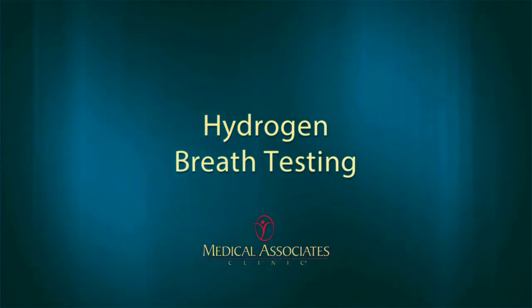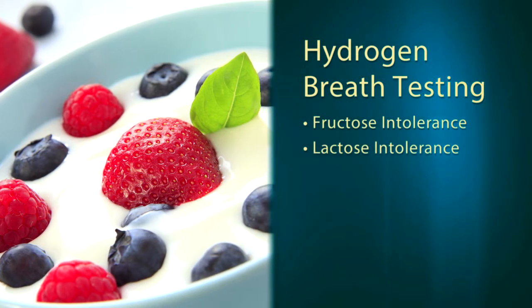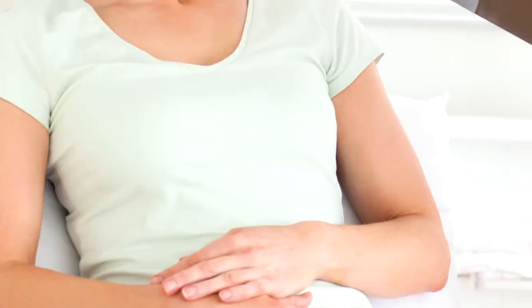Often we see people who have been previously diagnosed with irritable bowel syndrome. Those people are good candidates to do the breath test to look for something called fructose intolerance, lactose intolerance, and we also check for something called small intestinal bacterial overgrowth. The benefit of doing the breath tests is that they are non-invasive. We do them right in our office, so you don't have to go to a procedure area. And once you're done, you can drive yourself home.